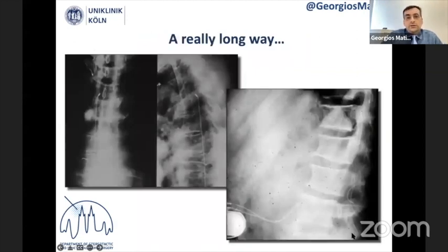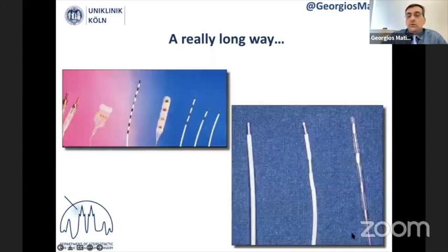And we started, or the colleagues started back then, with leads which had only one contact. Today, we have much more variety. We have leads with 16, with 8, with 32 contacts. Back then, we started with 1 contact, with 2 contacts, with 4 contacts. We have the percutaneously placed leads, we have surgical leads. So the options are really big.